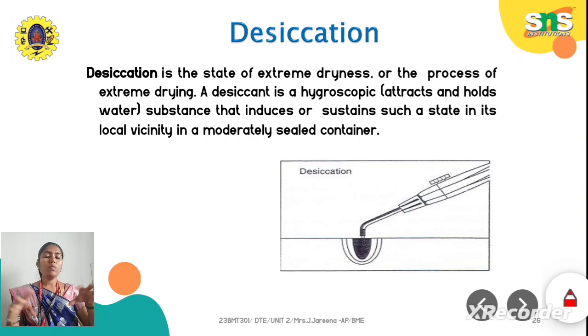So these are the four biological, that is physiological, effects that will happen in the ESU unit when you are passing high frequency current: one is cutting, another is coagulation, another is fulguration, and the last one is desiccation. So these are the four applications where you can use the ESU unit in surgical procedures. Yes, thank you.